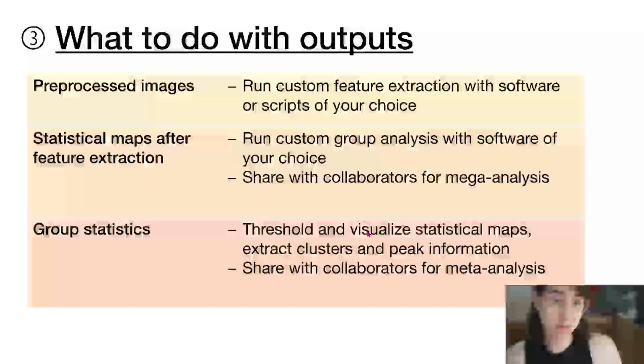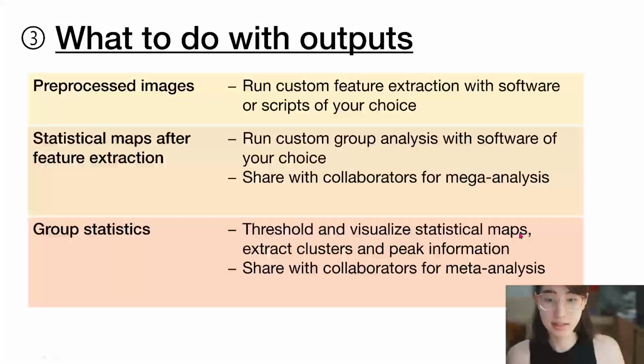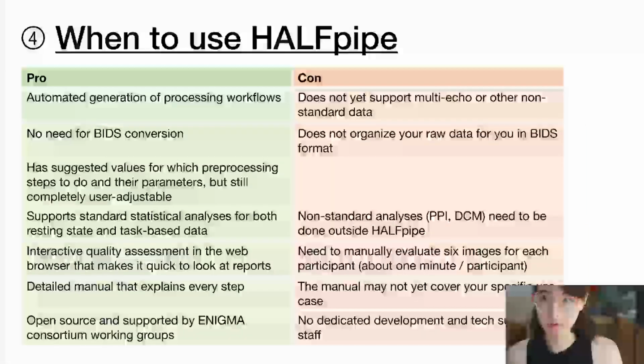That means you would threshold and visualize the statistical maps and extract where your clusters and peaks are. But you could also share those group statistics with others for meta-analysis, which is a really great use case for HALFpipe because it makes sure that everyone is doing the same kind of processing. And this is actually what we developed HALFpipe for.